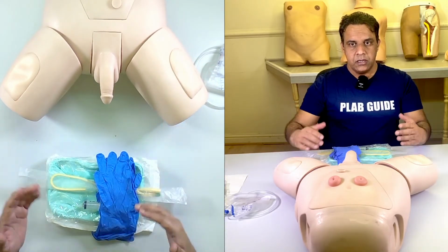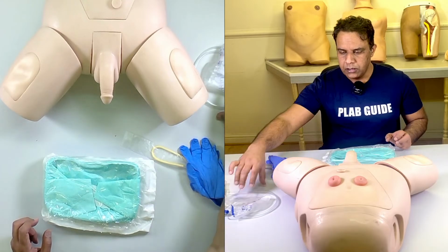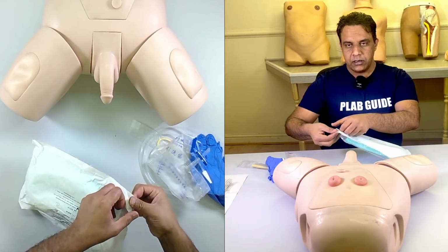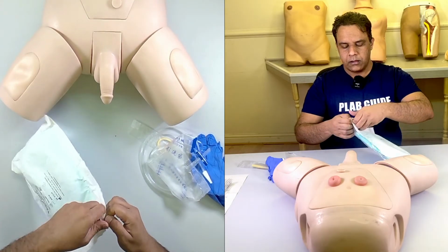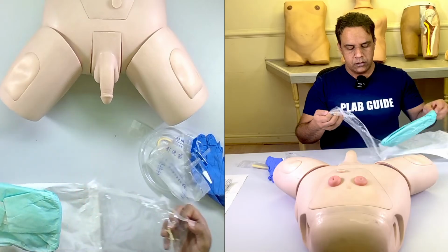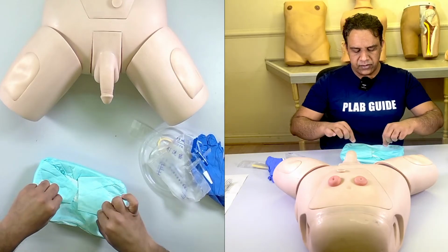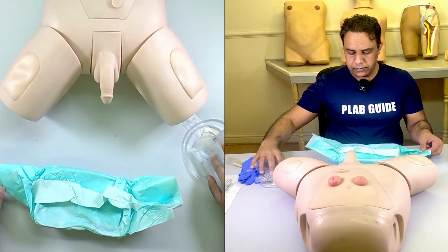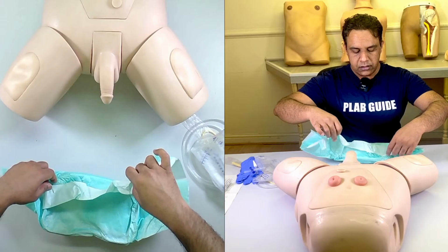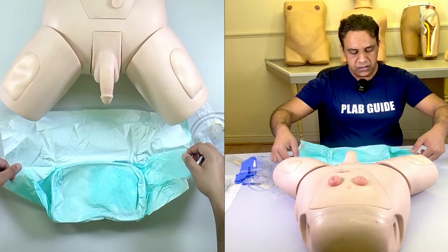After you've explained, the patient has made the position, and then you prepare your material. We have the urine bag as well. You prepare your material. This should go in the clinical waste. Make sure that you wear the non-sterile gloves when you are preparing the trolley and making your sterile field.